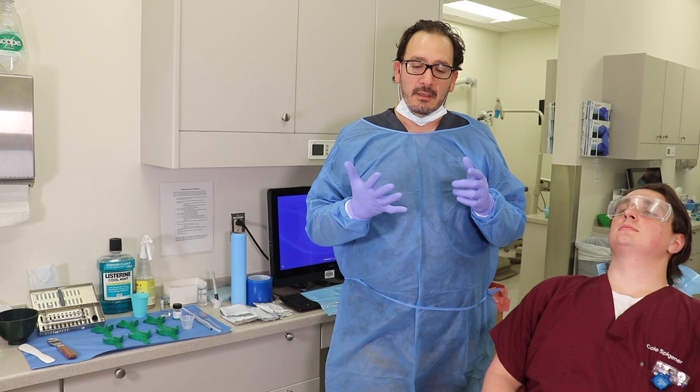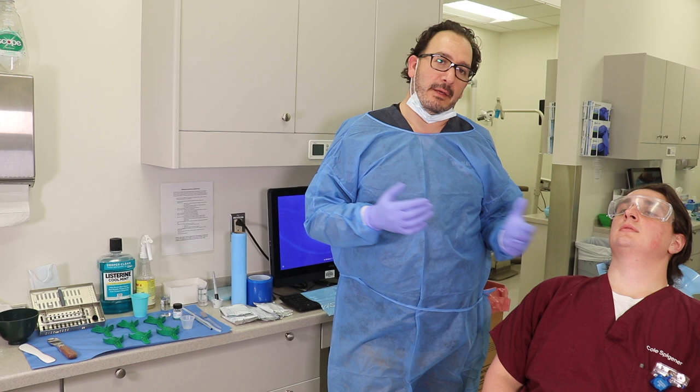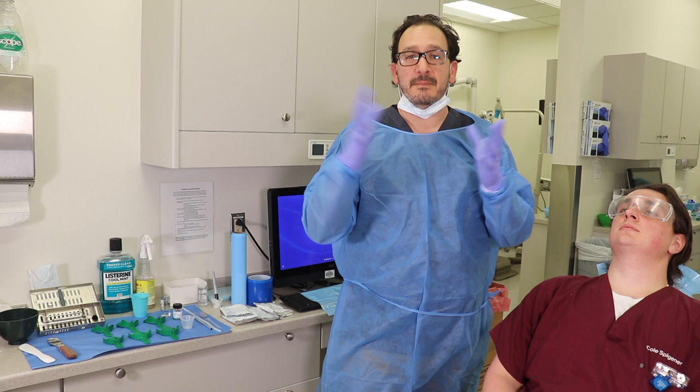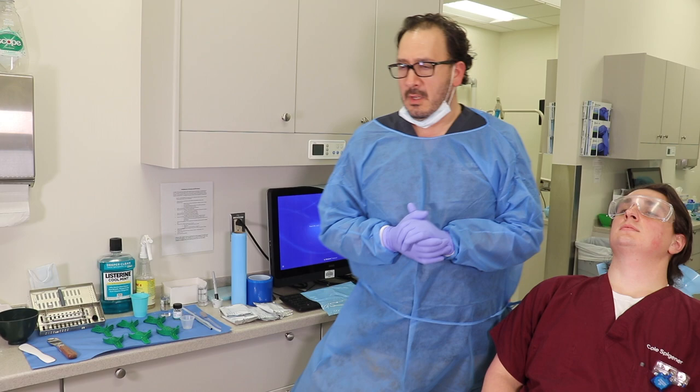Also, alginate impressions can be used for making some bleaching trays. We can use alginate impressions sometimes to do RPDs. And there are many other things that we can use a good alginate impression for. So in order to take a good alginate impression, we're going to go through the basics of this.